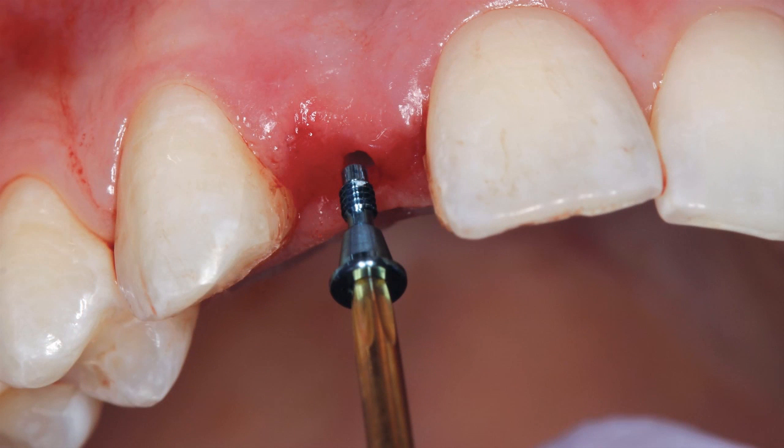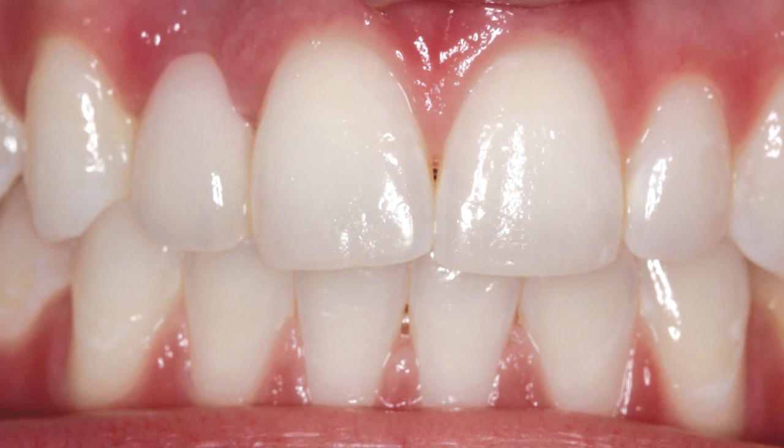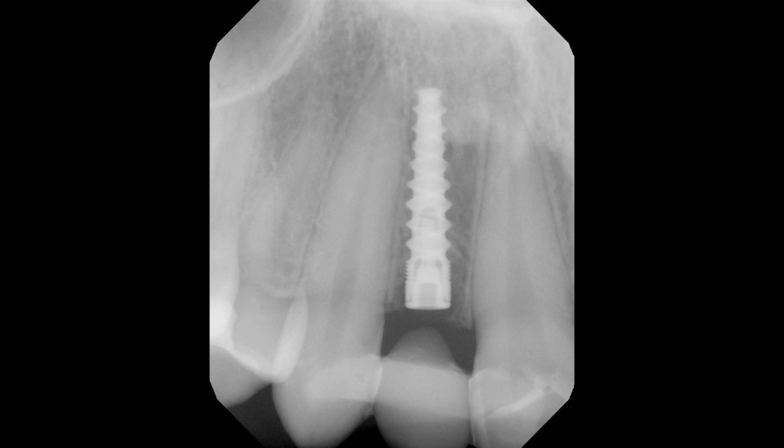Because her acid-etched bridge would function as a transitional appliance during the period of healing and osseointegration, a cover screw was hand-tightened into the implant. As illustrated in this radiograph, the implant was nicely positioned. Despite the small space that was available, a 3.0 diameter tapered implant was placed with ease. The patient's acid-etched bridge was then cemented back onto the adjacent teeth, and 4 months following surgery, the patient returned to begin the restorative process.